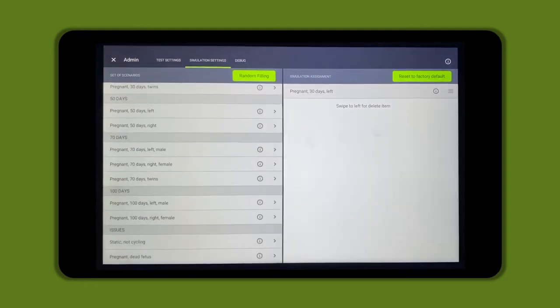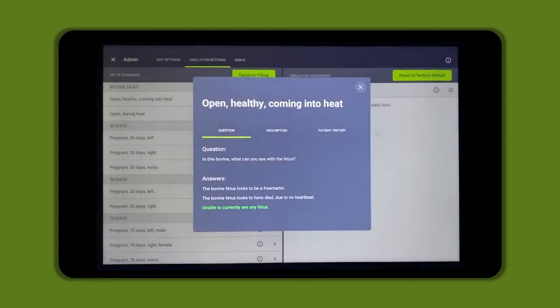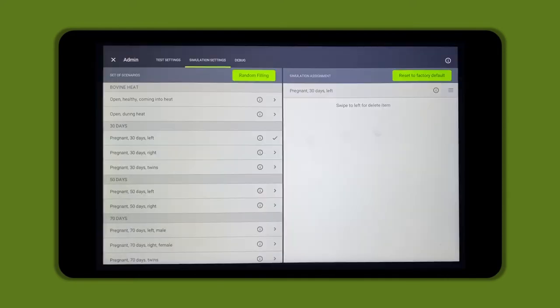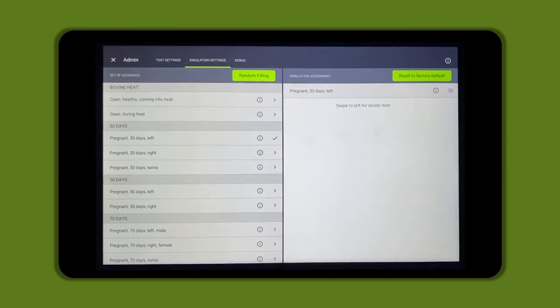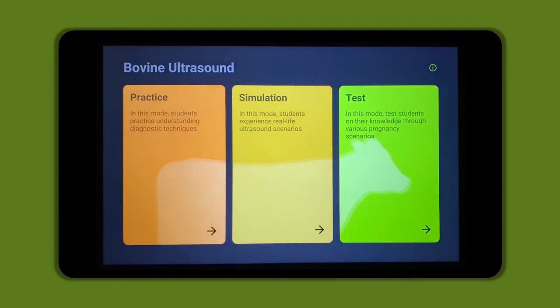To set up the simulation side, tap simulation settings at the top of the screen. You will see a list of 15 sets of scenarios for the simulation side of the ultrasound trainer. Tap the eye icon to review information for each simulation scenario, such as the questions and answers in green, a description of what the student will see on the ultrasound, and patient history. Select a scenario in the left column to add it to the test assessment. Drag scenarios up and down in the right column to rearrange them, and swipe left to remove them. Tap reset to factory default or use random filling. To exit the admin menu and access the student menu, tap the X in the upper left-hand corner.